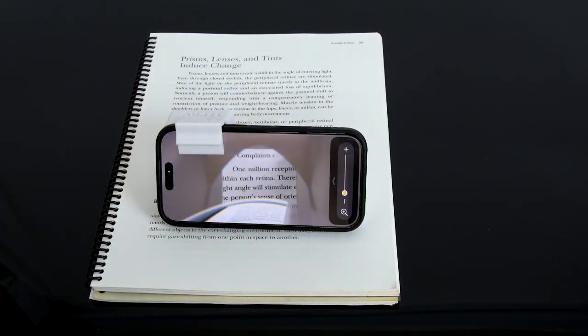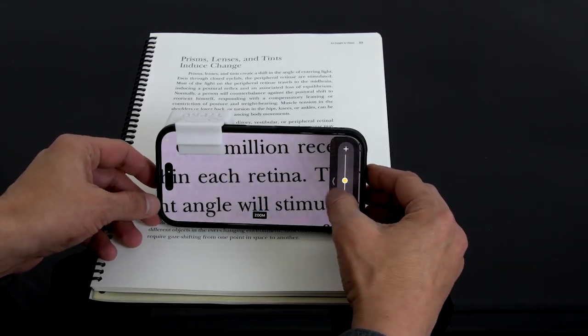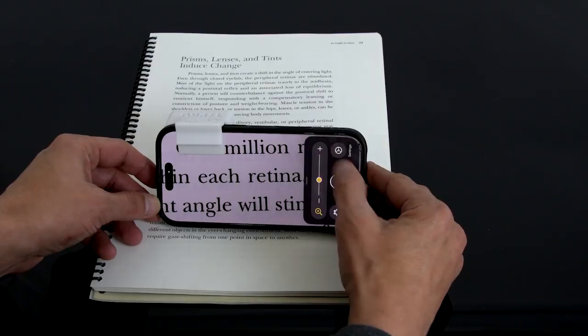When you first open the app, you might be too far from the subject. If you see the inside edges of the ADAVI, simply zoom in until the text fills the screen.